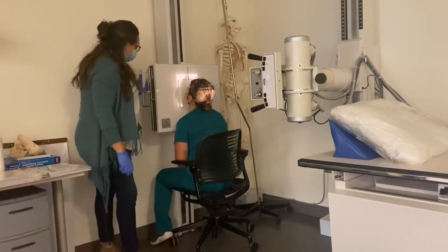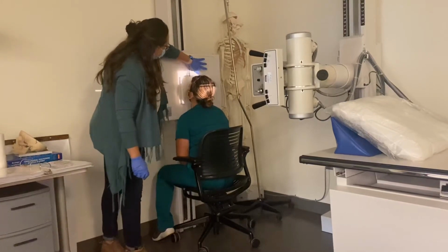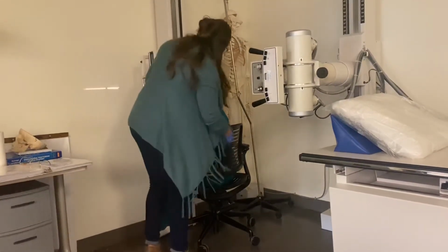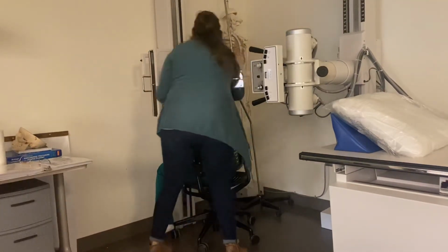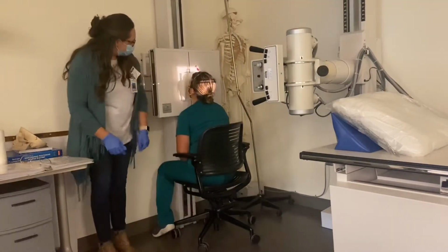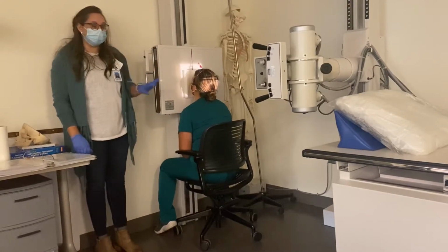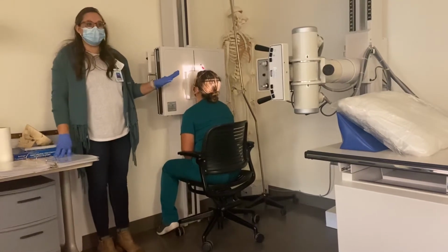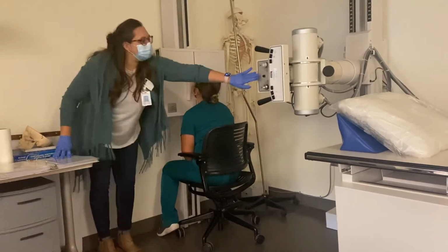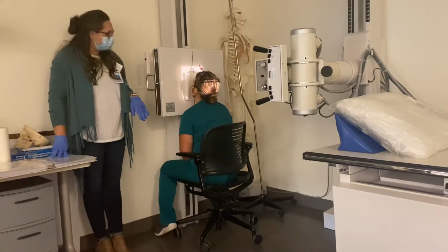This board's gonna raise up in front of you. I'm gonna move that board there. And then again, I'm gonna just check to make sure that there's no rotation and that her mid-sagittal line is centered. And I would have her hold her breath, don't breathe, don't move. If we were gonna do the open mouth Waters, we would stay in that same position, have the patient hold nice and still, and then just have them open their mouth as wide as they can.